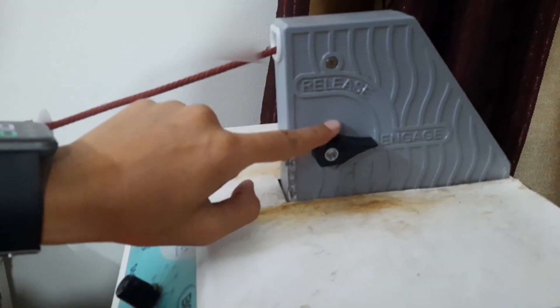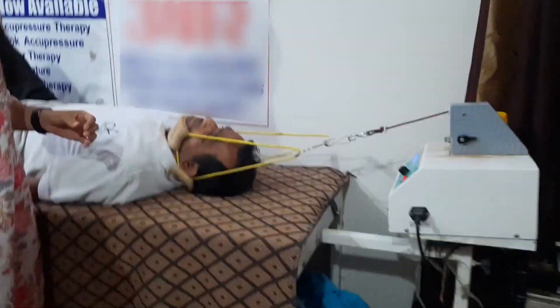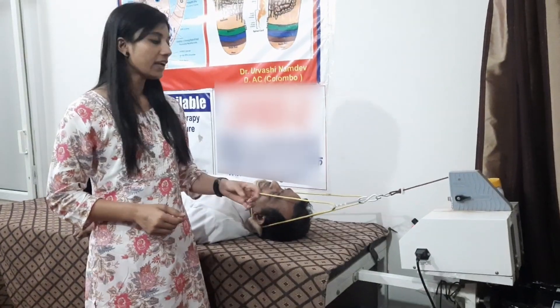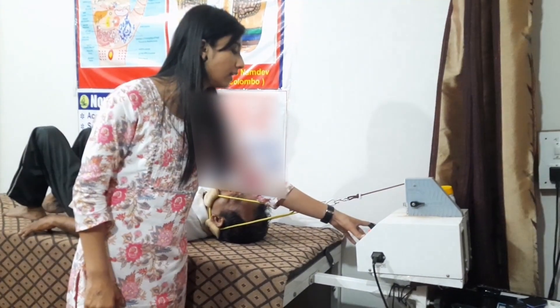We will engage the patient. We have set the cervical weight at 1/7th to 1/8th of body weight. I have fixed the traction at 5 kg and we will start the correction after that.